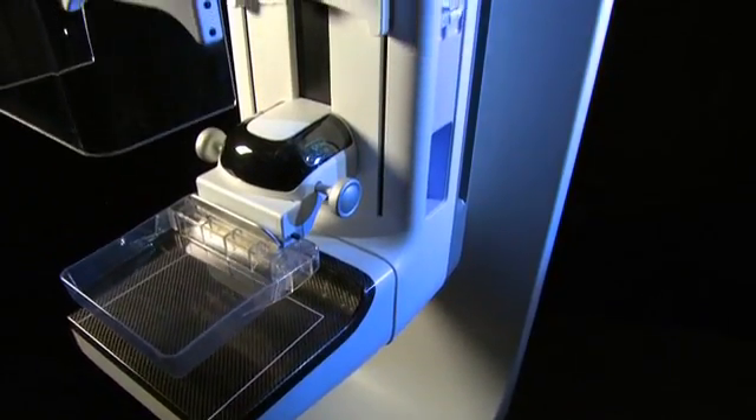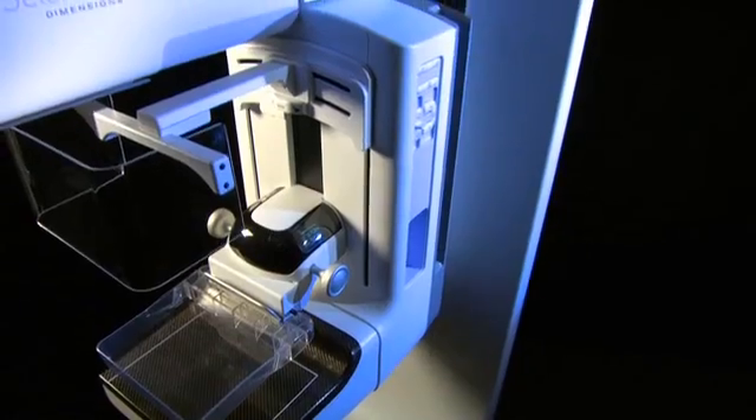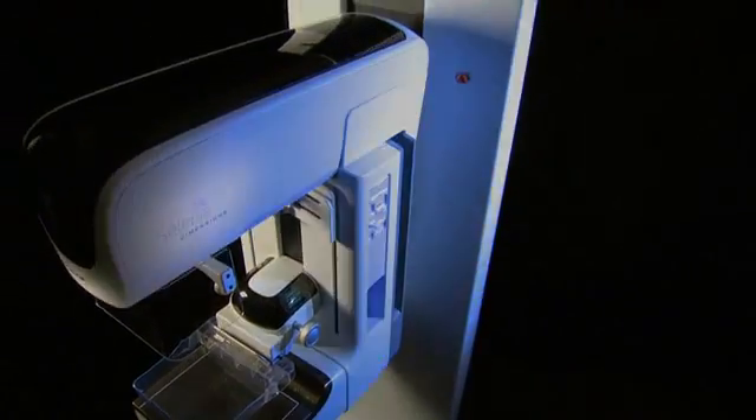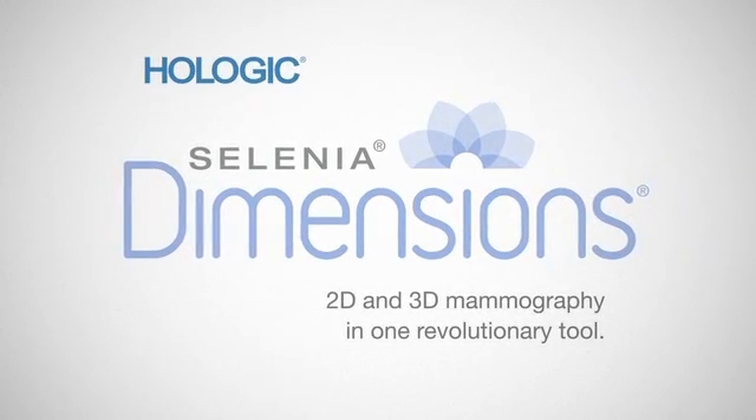Selenia Dimensions — a revolutionary new tool in the fight against breast cancer.